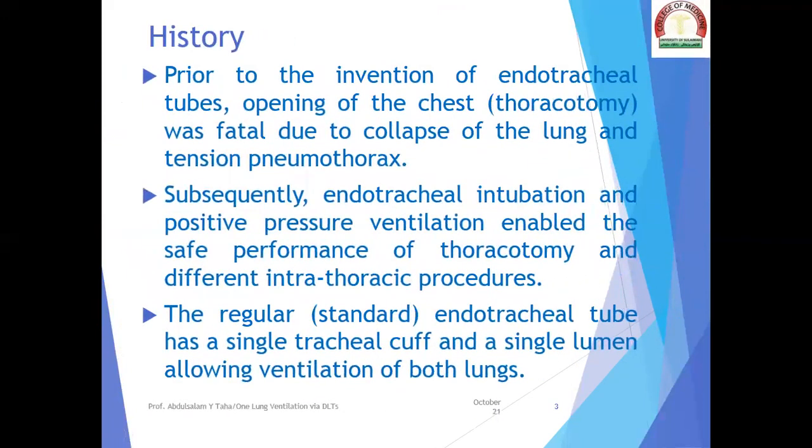History. Prior to the invention of endotracheal tubes, opening of the chest, that is thoracotomy, was almost fatal due to the collapse of the ipsilateral lung and tension pneumothorax.